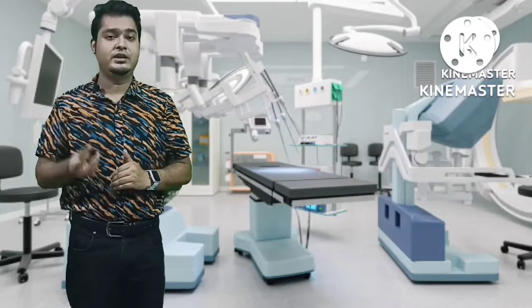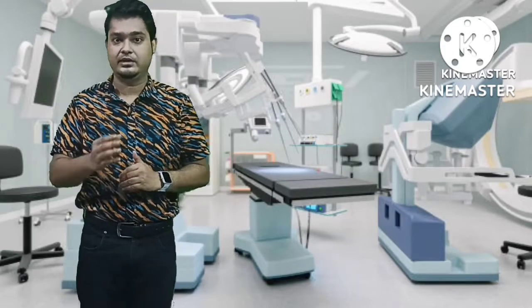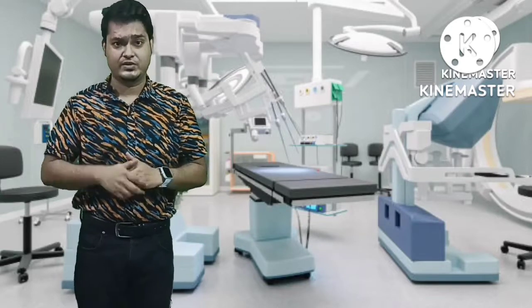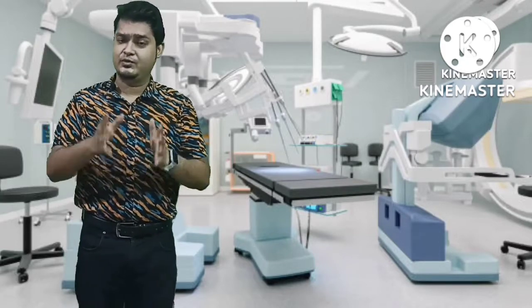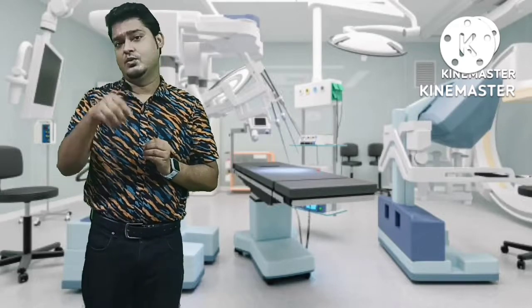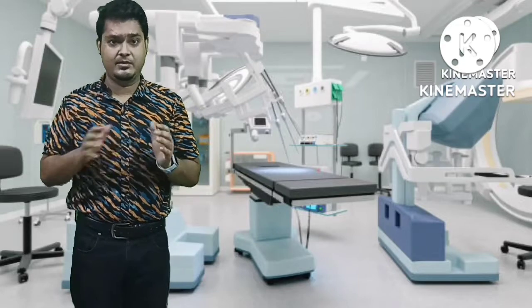Okay, so CT coronary angiography, with the help of the calcium scoring and the 3D images that can be post-reconstructed using software, easily demonstrates if any blockage is present in the heart. The catheter angiography will demonstrate the blockage, and with the help of the catheter angiography we can also clear that blockage with the help of the balloon or stent. So this is the main difference.